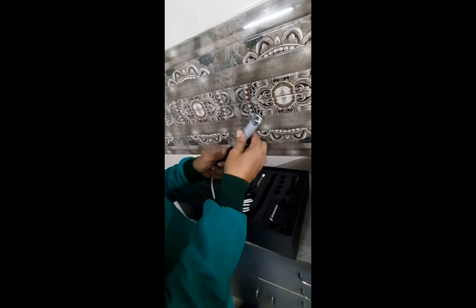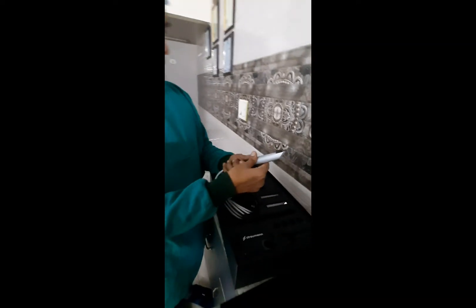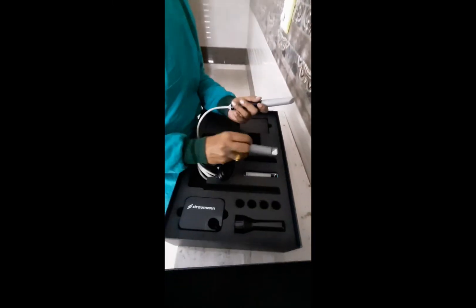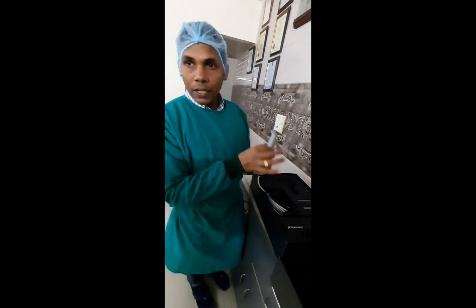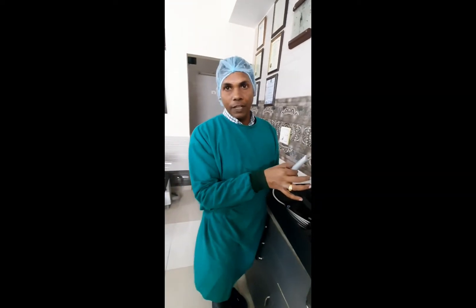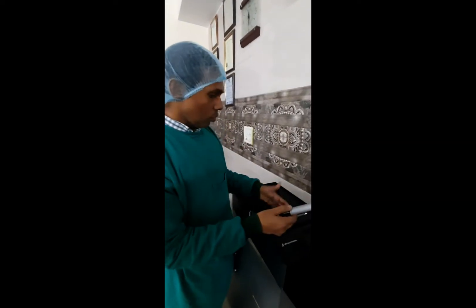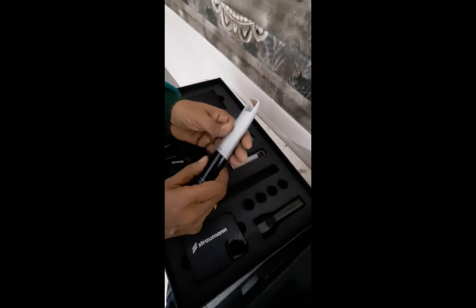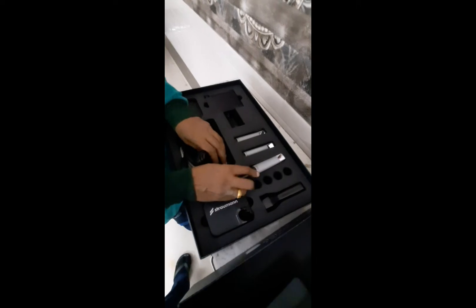You just rotate it and place it back — that's wonderful! You have three sleeves which are given with this, and what I know is that each of these sleeves can be autoclaved 250 times, so you have a long life and replacement is also not that costly. This is very good.